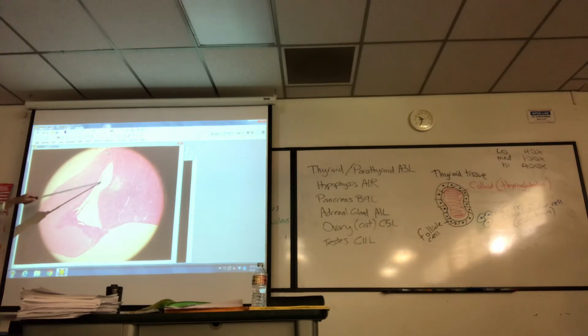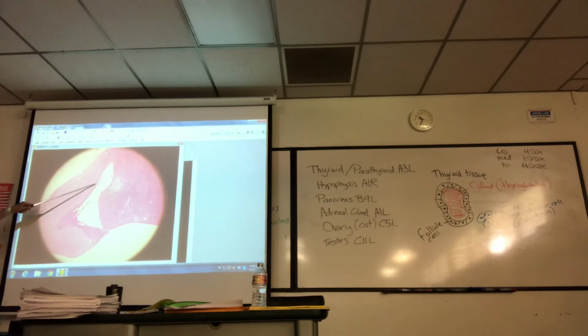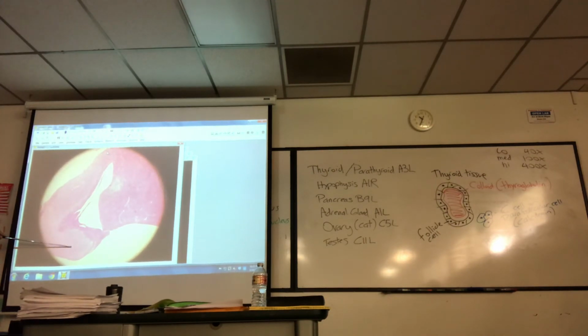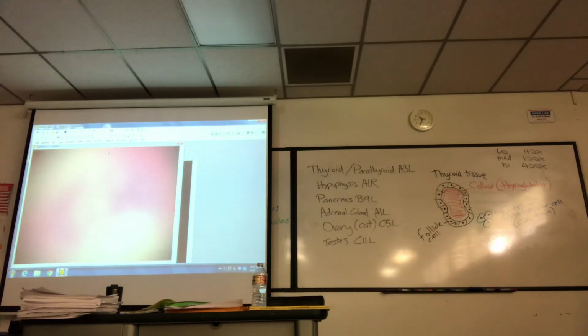You have this big divide here, there's nothing, but that's anterior pituitary. See this darker tissue here, pars intermedia? This is posterior pituitary down here, followed up by infundibulum, okay? So infundibulum up here, the lighter stained tissue. If I point down here, posterior pituitary. Pars intermedia, anterior pituitary, that's what you've got now. Moving on.